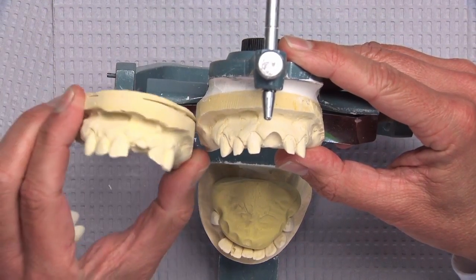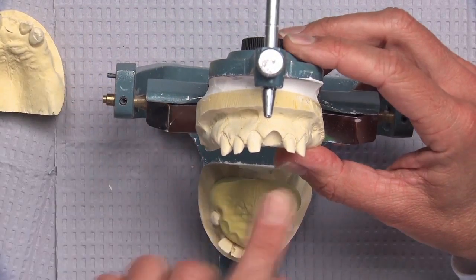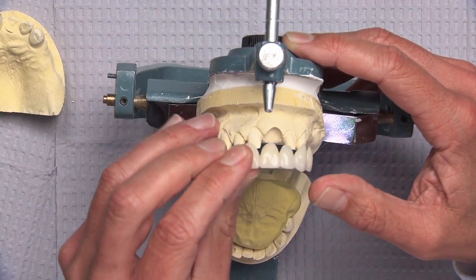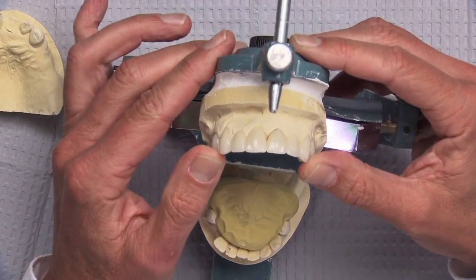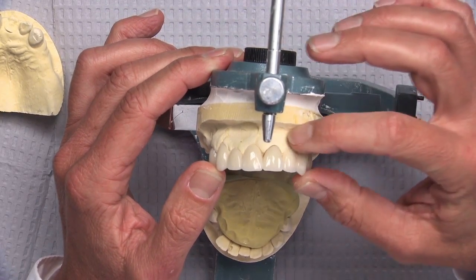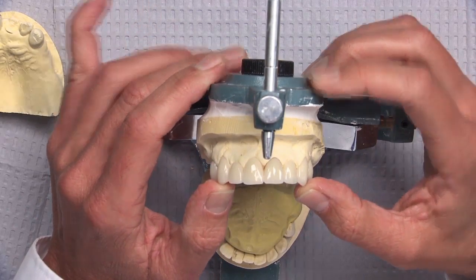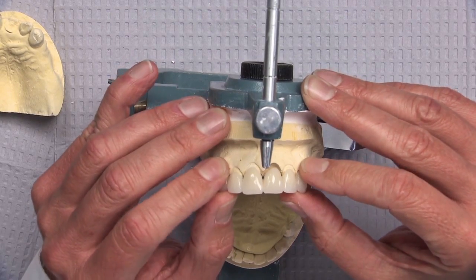This is a great opportunity because we've got that broken down tooth in place — the day we do the extraction of that tooth and the one behind it, we're going to have an open socket. So it's perfect: I don't need to pack anything in that socket, I just need to extract the tooth, squeeze it with cotton gauze, and then reline the bio temp bridge into that spot. We're going to end up with an ovate pontic receptor that the tissue is going to heal right around. We give this six to eight weeks to heal, and by the time the tissue has healed around that bio temp ovate pontic, it's going to look perfect when it comes time to make the final permanent restoration.